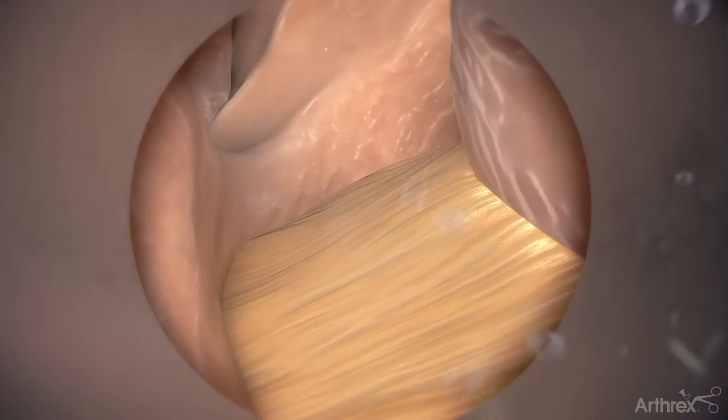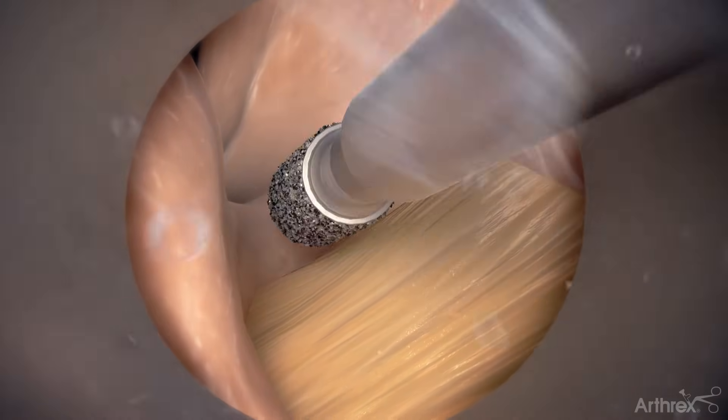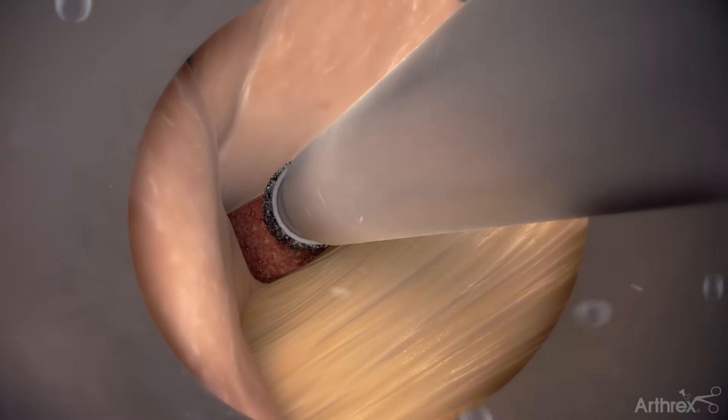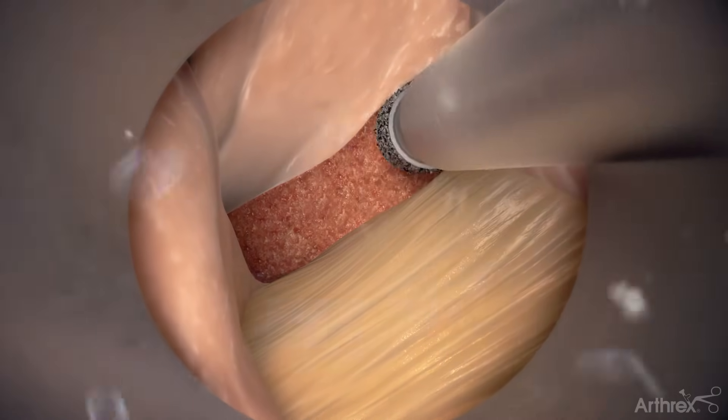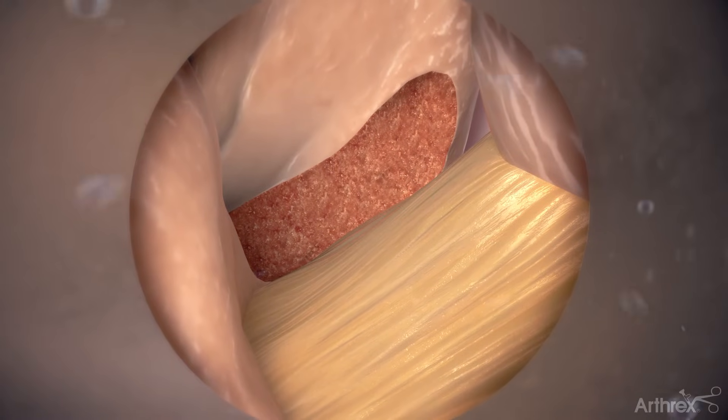Insert a burr through the working channel of the endoscope. Use the burr to undercut the caudal edge of the upper lamina on the contralateral side, creating space for the ligamentum flavum. Remove bone tissue with the burr until both the superficial and deep layers of the ligamentum flavum are exposed.